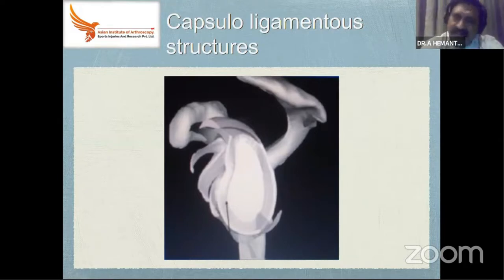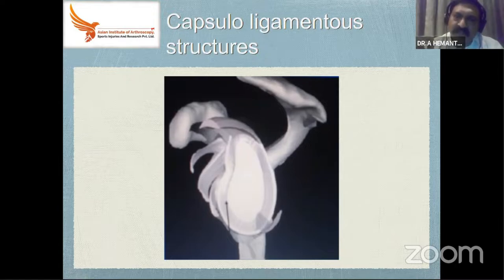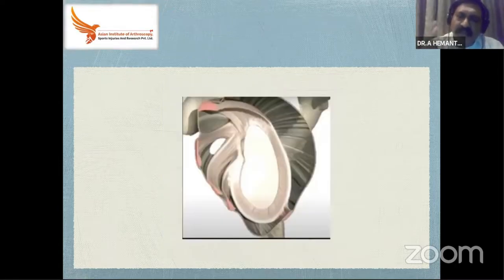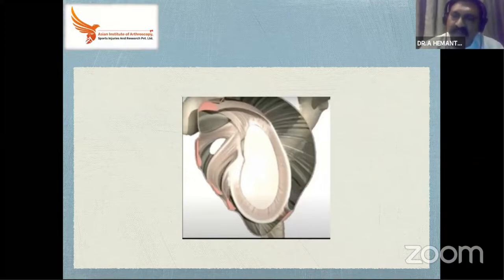There is a capsule which has thickened at multiple levels: the superior glenohumeral ligament, middle glenohumeral ligament, and the inferior glenohumeral ligament — all attached to the glenoid. This is how it looks. The ligaments are essentially thickenings of the capsule; they are not separately identifiable structures.